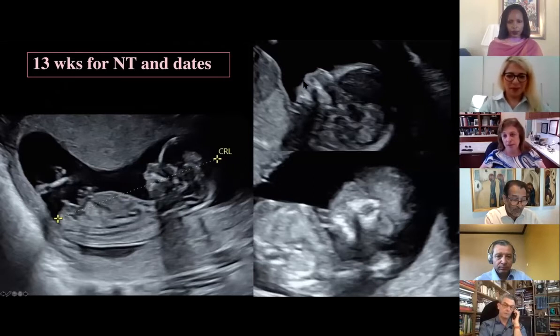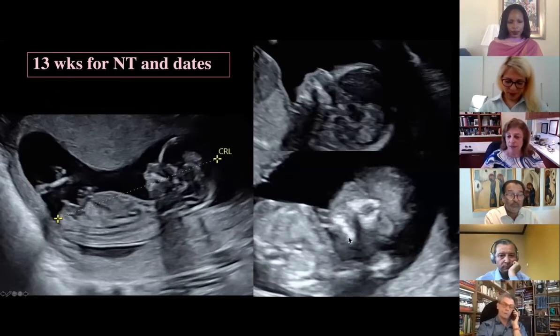This might be a little more subtle. You might worry that maybe you're not at a good angle. Sometimes if you're off a little bit from the midline, you can make it look like that. But if you look at the mandible itself, you'll see normally there is a gap here. And when there is micrognathia, the gap disappears. So there's a lack of mandibular gap right here.